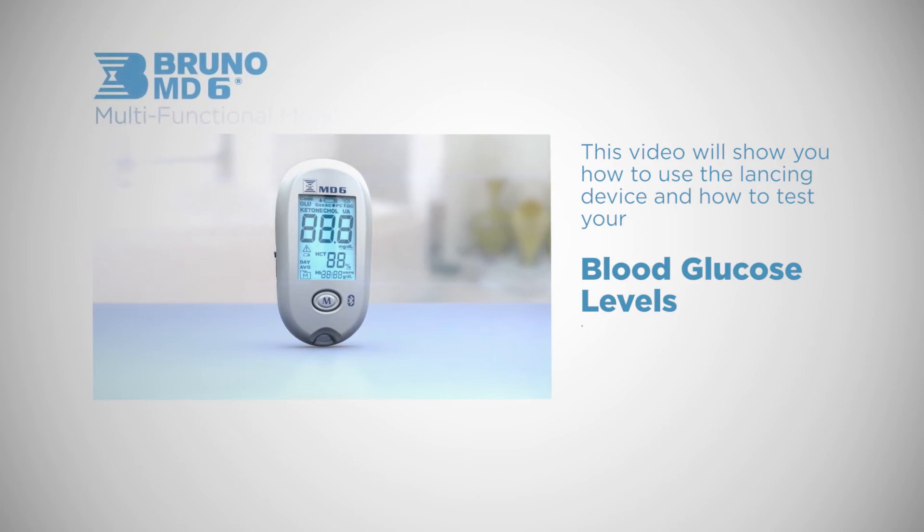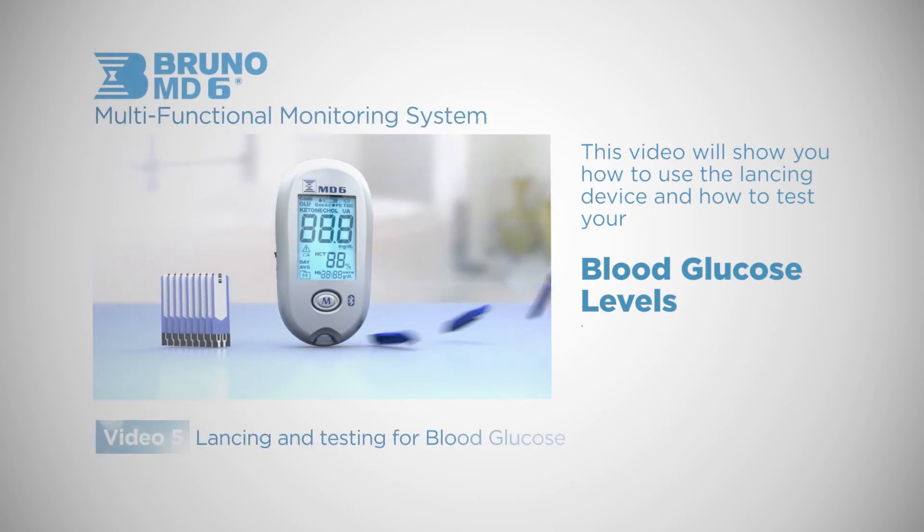In this video we will show you how to use the lancing device and how to test your blood glucose levels.